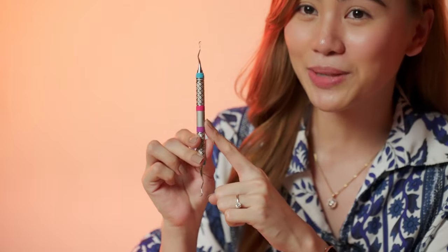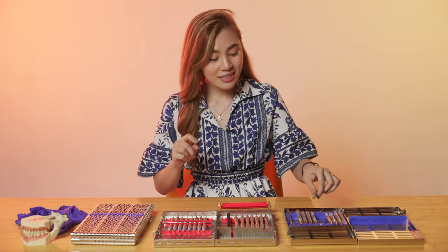So look at my old instruments. This is the area where I place my label tapes kasi you want good grip in this area. So unlike this instrument, yung label tapes nandito sa area na to, this is one of the first Friedy instruments I bought, I think, way back 2012.